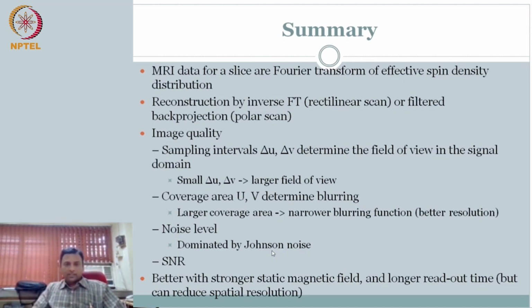You look at the image, then close your eyes and see: I know how to interpret what this white means, what this black means, what this gray means. I know its units. I know the physics of the signal, and I know what instrumentation dictates the limits of interpretation of the signal. You should do it for each modality quickly. If it is X-ray CT, I know it is related to X-ray attenuation, the material's attenuation property for X-rays at that particular energy. That is the fundamental signal. Then of course you convert to Hounsfield units in the X-ray CT image.